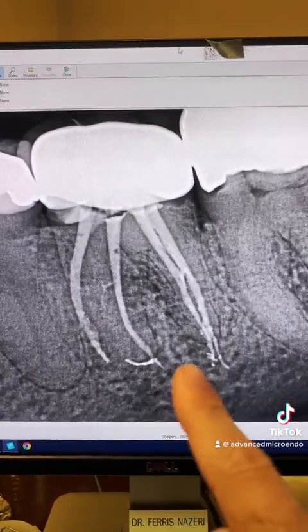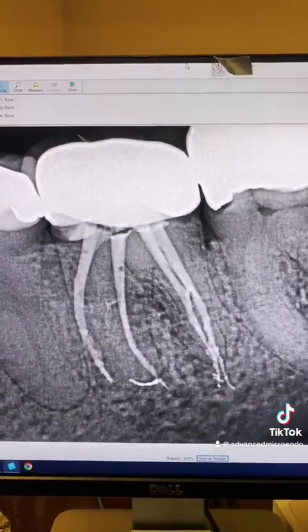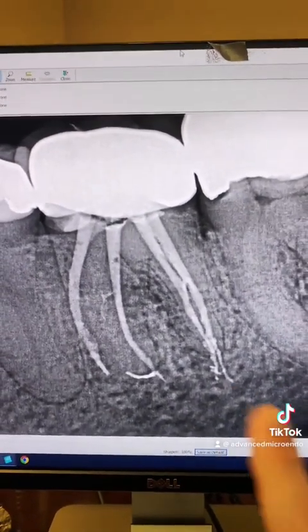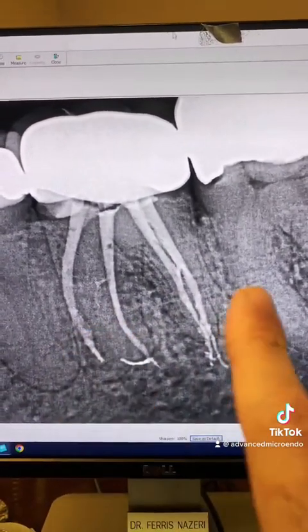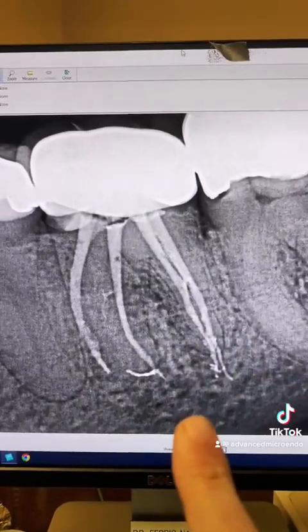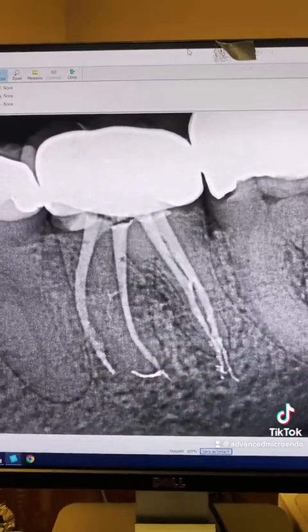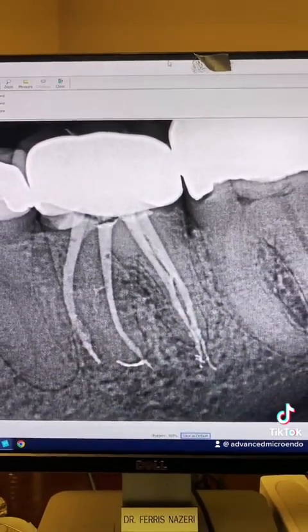This is just syringe irrigation with full strength sodium hypochlorite, and then sonic activation. And look at all of this anatomy that you pick up, okay? So stainless steel K files and reciprocation, full strength hypo, syringe irrigation and sonic activation, and then warm vertical obturation.